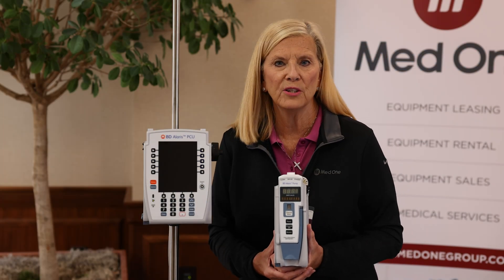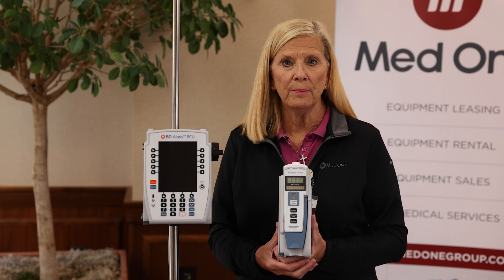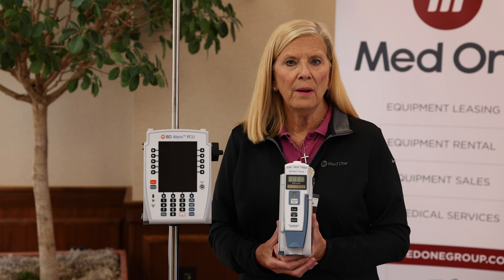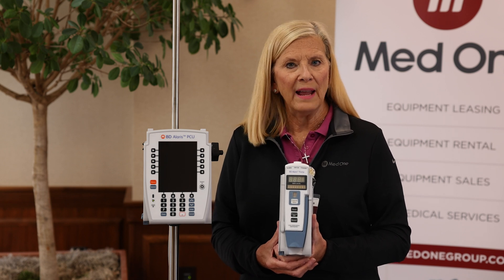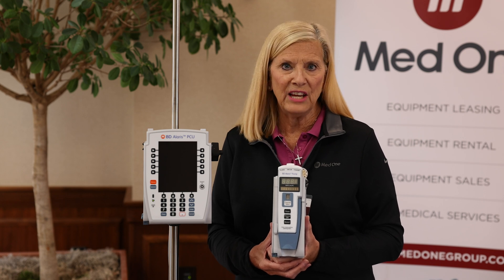We're going to talk about one of the modules in the Alaris system. It's model 8100, the large volume pump module, or LVP. The large volume pump modules are used for your IV fluid infusions, blood, intermittent, and continuous medications.